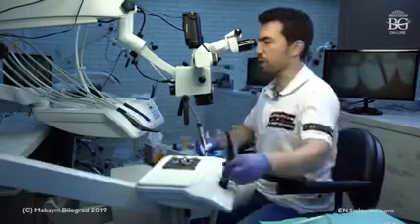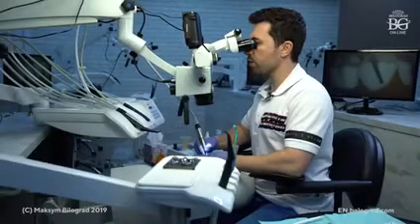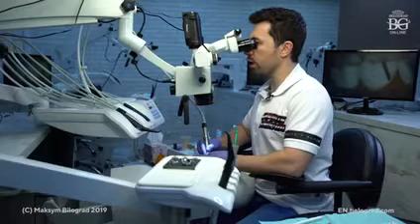Okay, so I think that we can say that we finished preparation for molar. I'm not going deeper here on the cervical area, but in the real patient case, depending on the type of smile, I also would go more here just to mask.